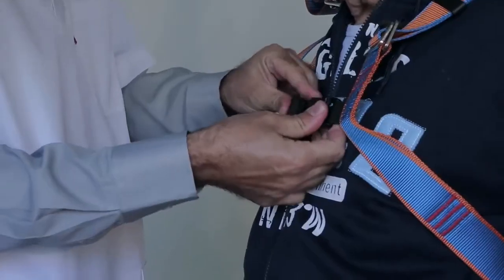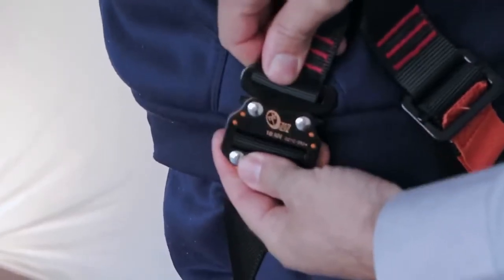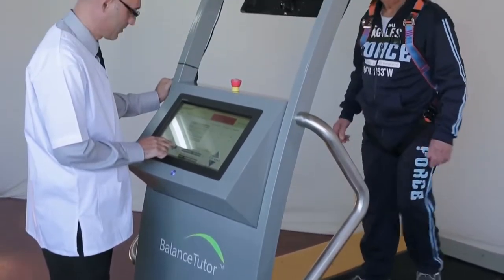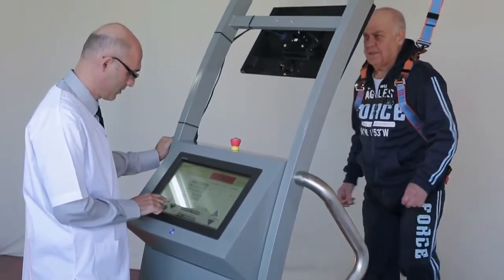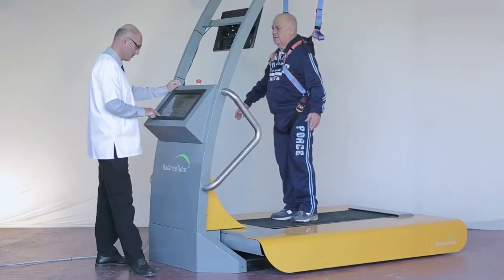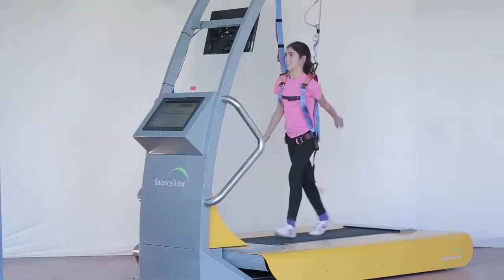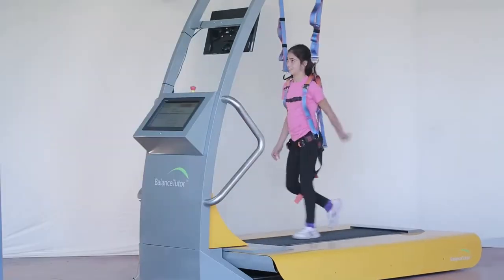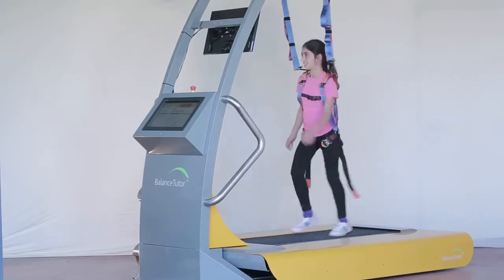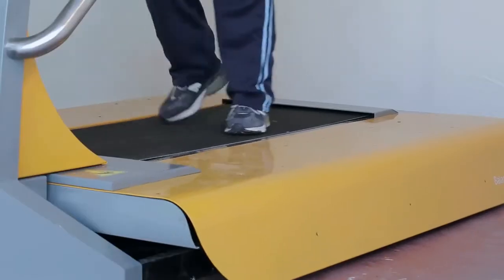Scientific research shows that compensatory response needs to be specifically evaluated and practiced in both the static and dynamic mode using unexpected perturbation. Medi-Touch has developed the Balance Tutor, an innovative dynamic and static postural control and gait trainer.